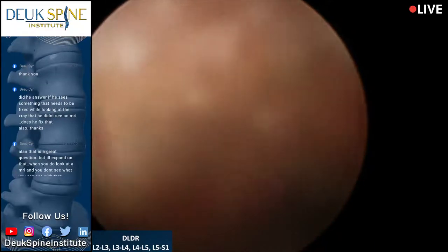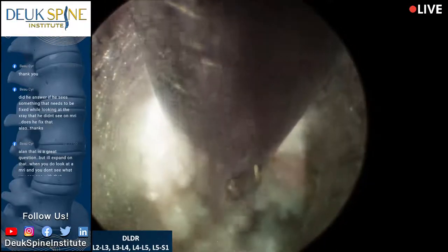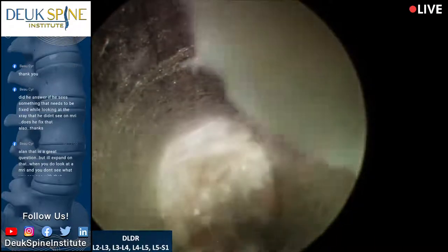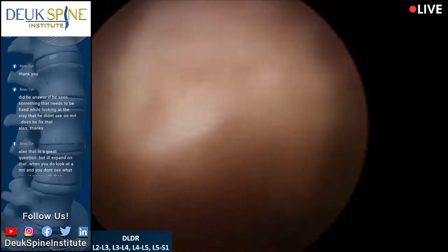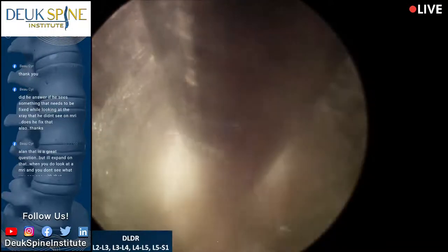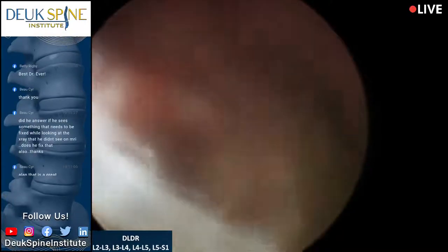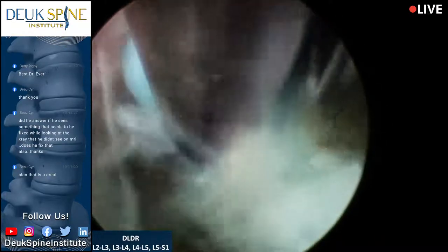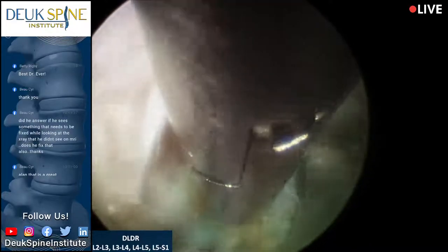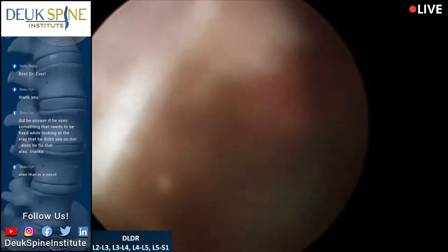All right, again, I apologize for the bad view. It's a little bit of oozing. There's so much arthritis and inflammation at this area that it's literally oozing a little bit of blood from lots of surfaces where there was inflammation, and that's what we're here to fix. The reason there's so much inflammation goes back to the herniated disc. Disc herniations cause back pain through inflammation. Wow, this is incredible, huh? This one disc is so badly damaged.